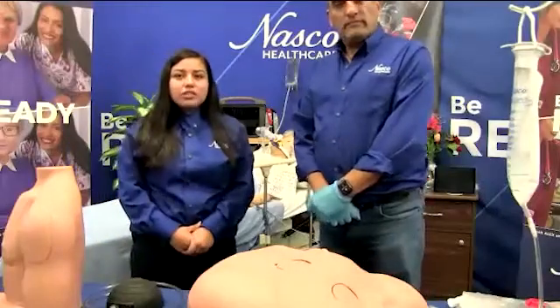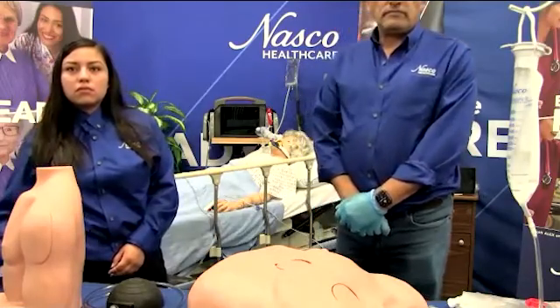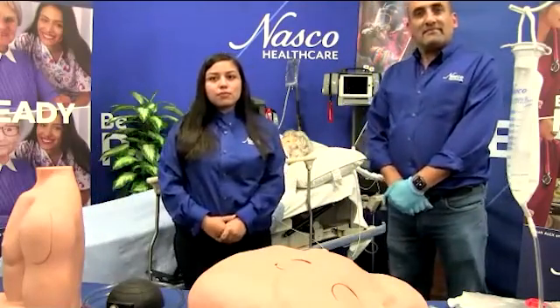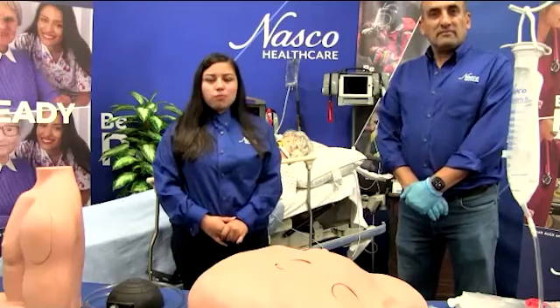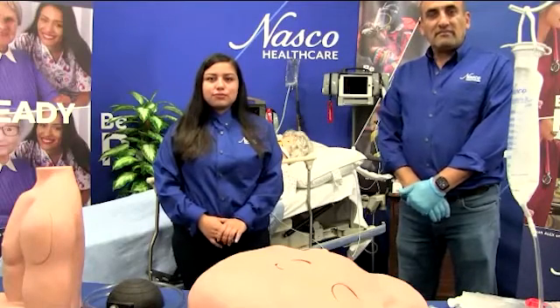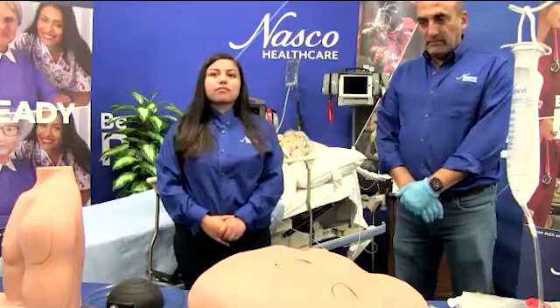Do we have any questions on the pericardiosynthesis simulator? Wendy, I see a question here: what is the weight of this simulator in pounds? This simulator weighs less than 15 pounds, so it is very good for use in any simulation room setting or in a remote location. Also, regarding the warranty for this product — that is a five-year warranty.